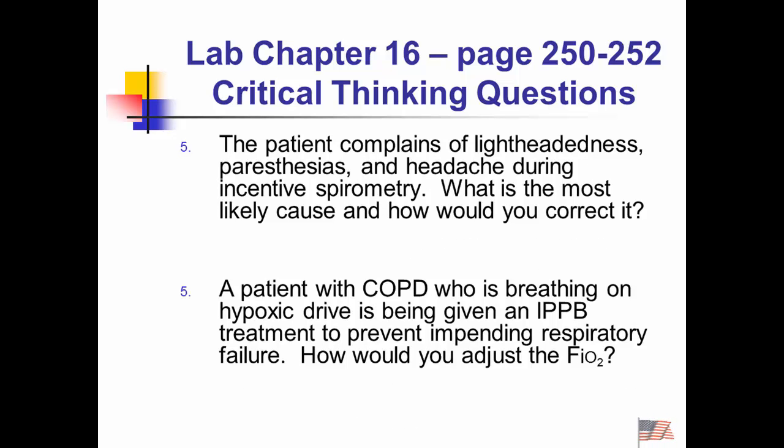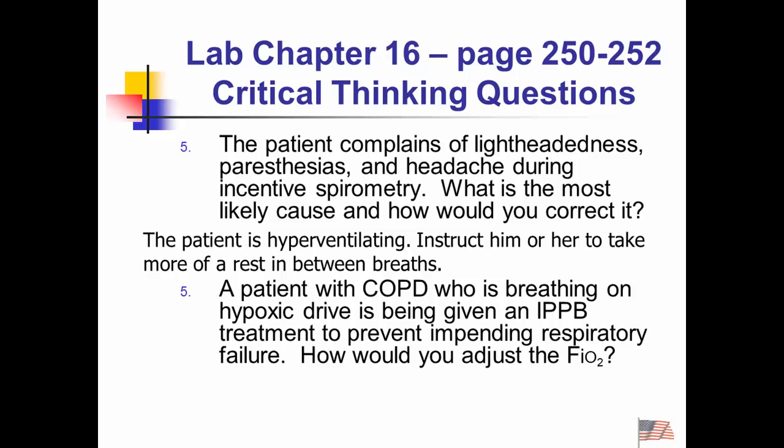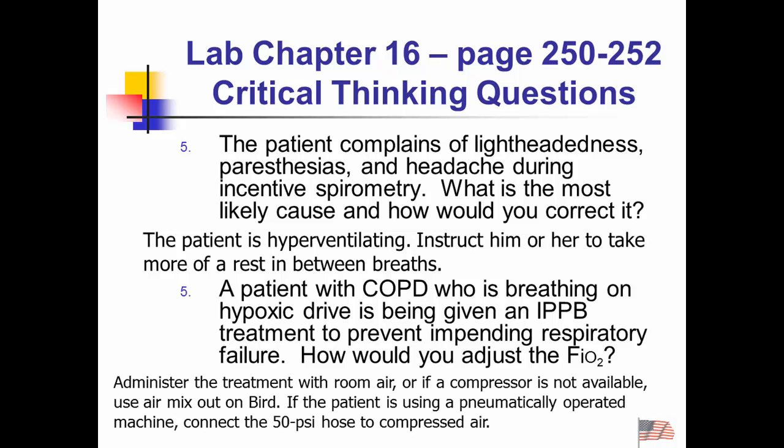Patient complains of lightheadedness, paresthesia. What's paresthesia? Tingling in the fingers. Headache during incentive spirometry. What would you do to correct it? Slow down. They're hyperventilating. Patient with COPD who has oxygen-induced hypercapnia. What would I want to do? Well, how about if I administer the treatment with room air? Don't use oxygen to power the unit. We can hook it up to a compressed air flowmeter just as easily.